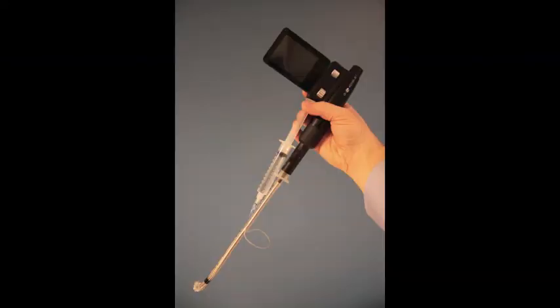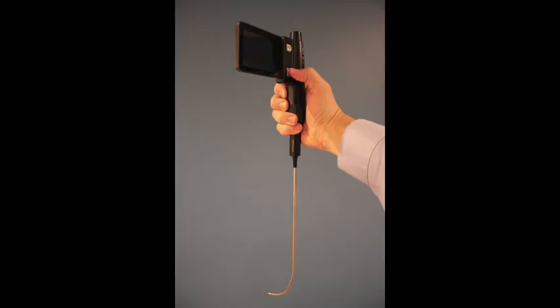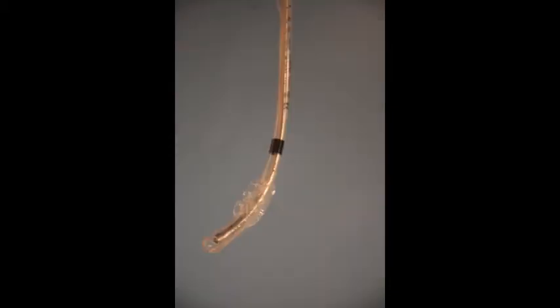EVS has purchased this remarkable and novel intubating device for the benefit of its providers and the patients that it serves. The Clarus Videoscope is a fiber optic stylet. The core transmits lights and images from the tip over which an endotracheal tube is placed. The image is displayed directly on the video screen. The device is held in the dominant hand and is relatively easy to use once you know the basic steps. We will review the basic elements of the design and how to use this device prior to your hands-on training.